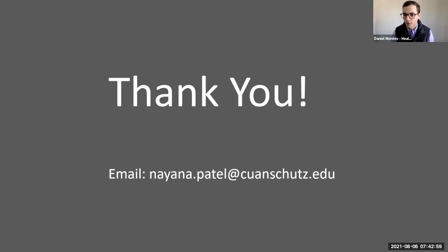We have a couple more questions. We have one in the chat box that says, is there a role for transabdominal or transrectal ultrasonography in the evaluation of prostate cancer? Well, good question.